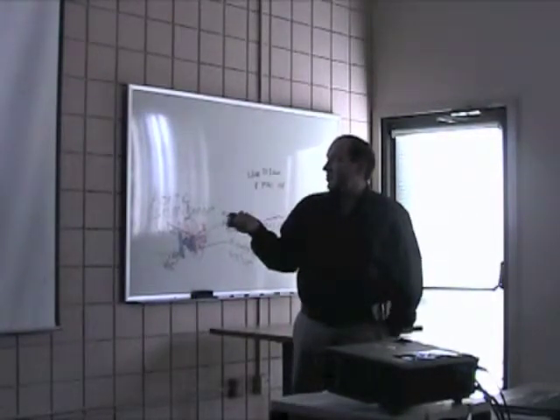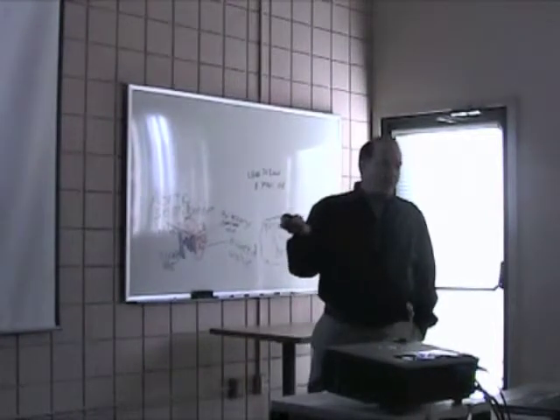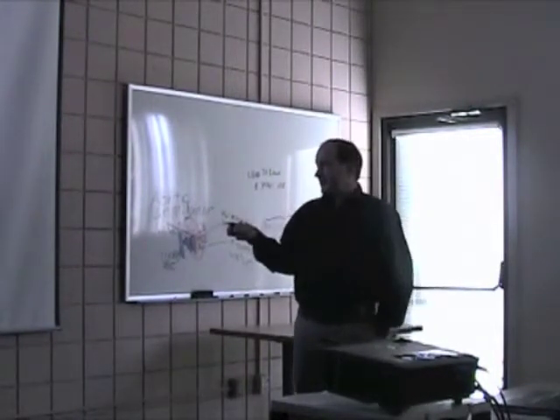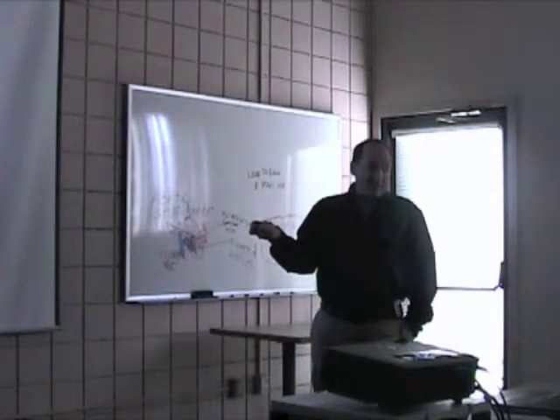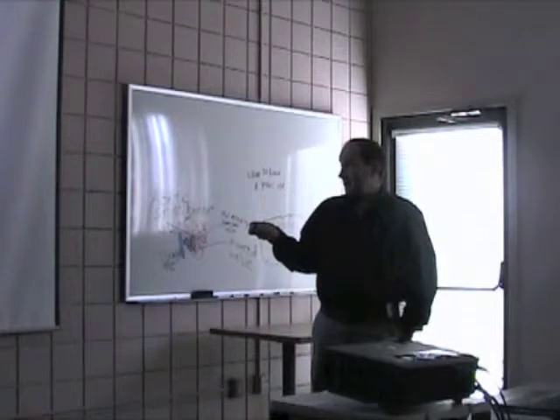So this would be called a valve-sparing aortic aneurysm operation. We do a lot of these too. These are the sutures that you put in to implant either a valve or the aortic replacement graft as well.